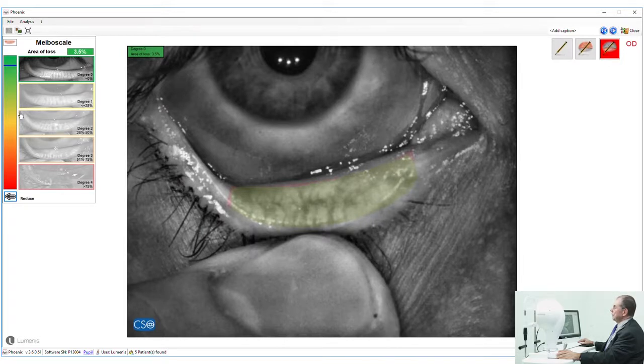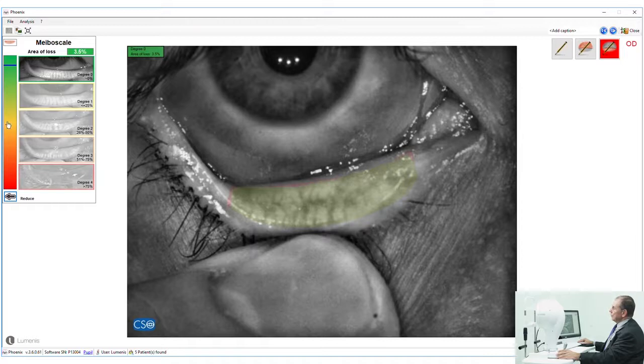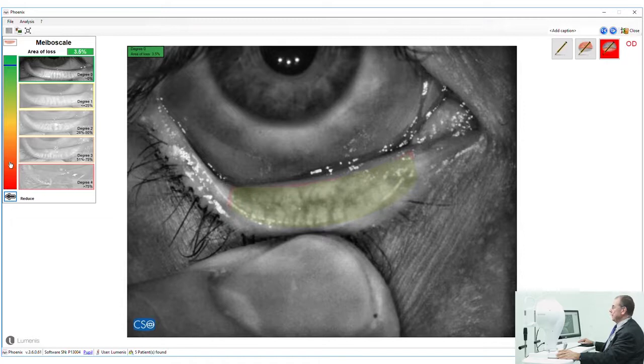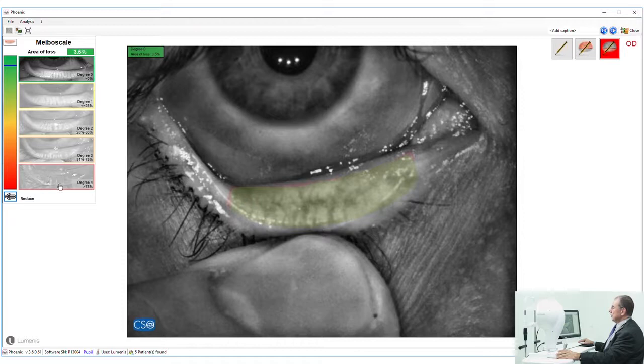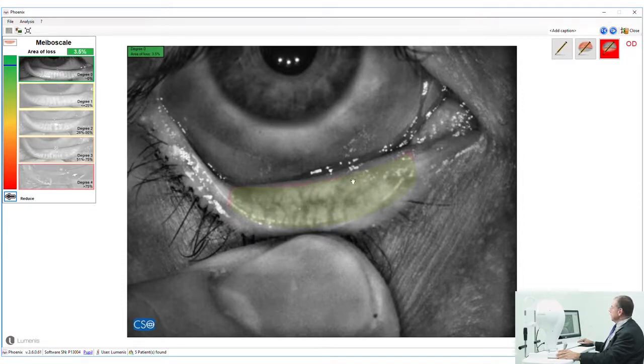If we're in the green we are okay. If we go into the yellow, we've got a suspect problem. And if we're in the red, then obviously we have a higher degree of what they would call loss of the meibomian function and we would see hardly any meibomian glands at all.